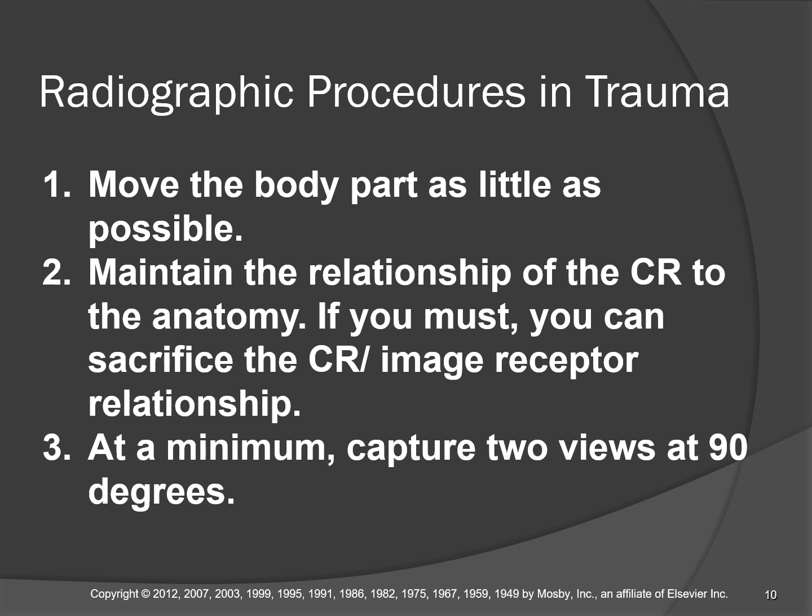Like for example, let's say a trauma oblique C-spine, that's a great one. We don't see those much anymore, but those are fantastic views. Now, in order to do an oblique C-spine, you've got to use a 15-degree tube angle toward the head, and then you need to rotate the patient's body 45 degrees, but you can't do that. So you have to invoke a transverse angle with the pivot button because the tube angle is already 15 degrees cephalad.